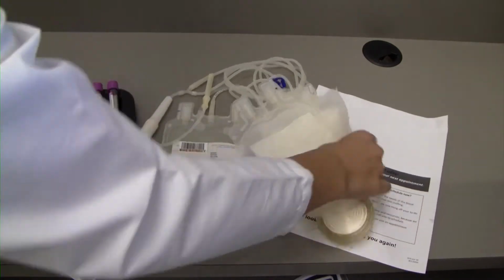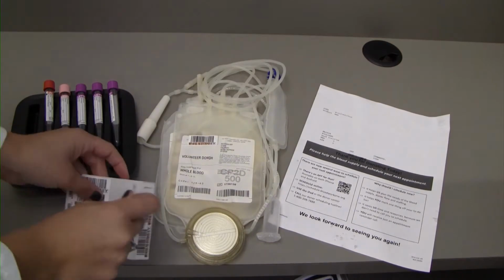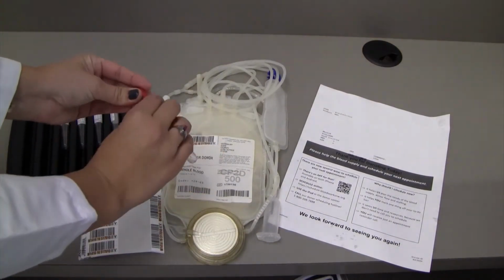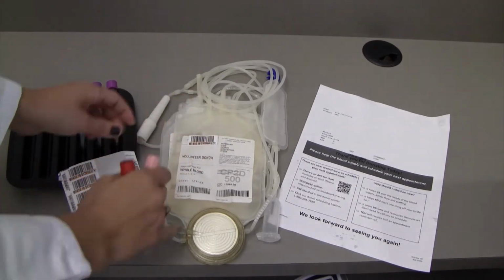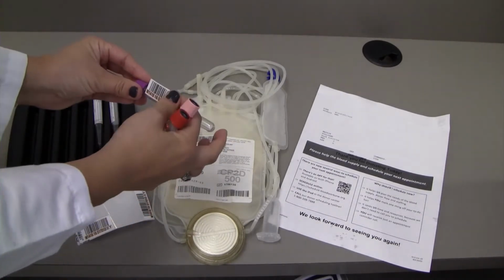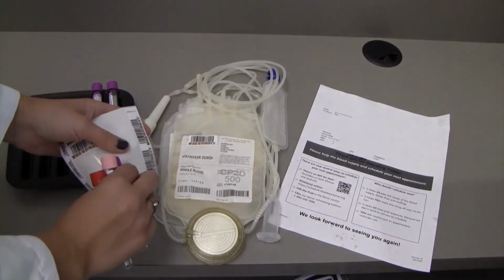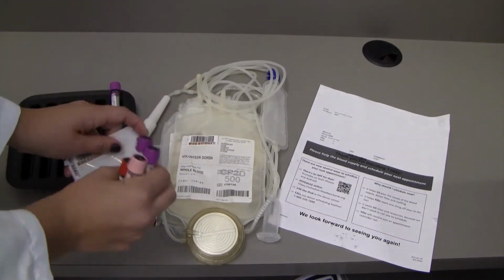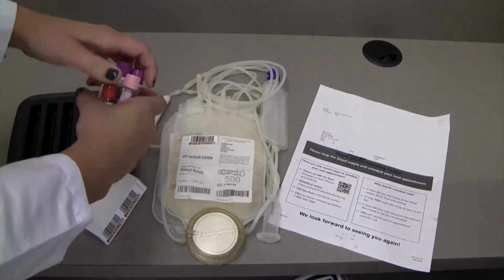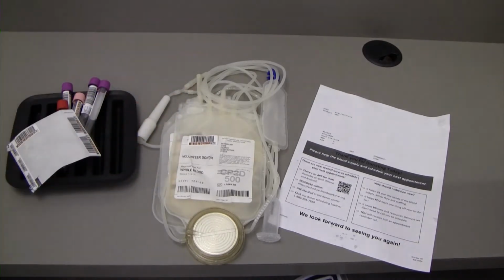Apply large DIN to each of the tubes. You will need 1 6-ml serum red, 3 6-ml EDTA lavender, and 1 6-ml EDTA pink. Place unused DINs with labeled tubes.